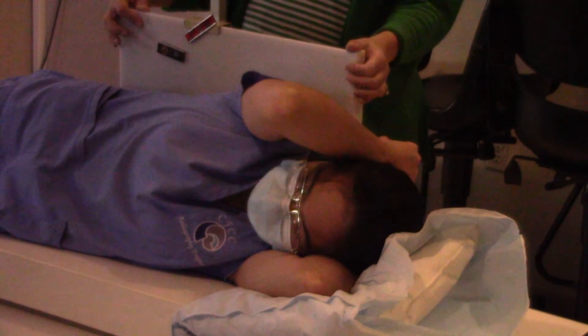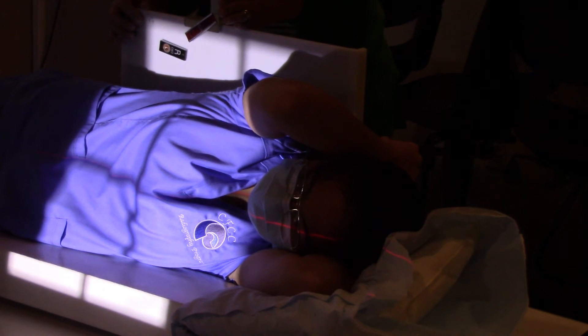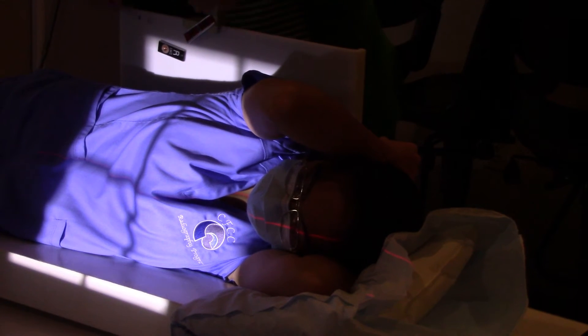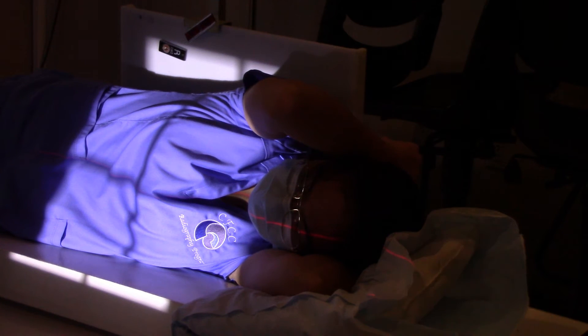I think that looks pretty good. The only thing is, you could narrow your collimation down a little bit more. Come down a little bit more — there you go. We just got a piece of the pillow, which means the diverging ray is going to catch all of her lungs. We're centered top to bottom, side to side. You've got about as much SID as we can get, given the limitations of our equipment.